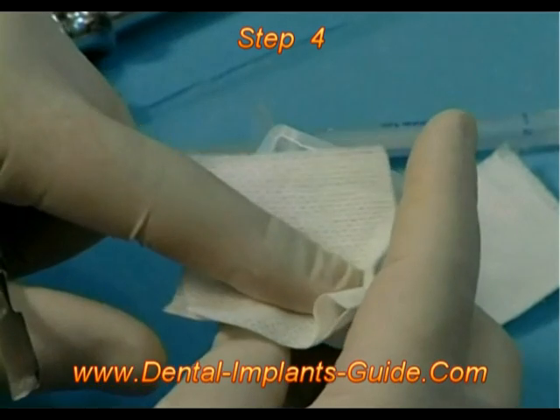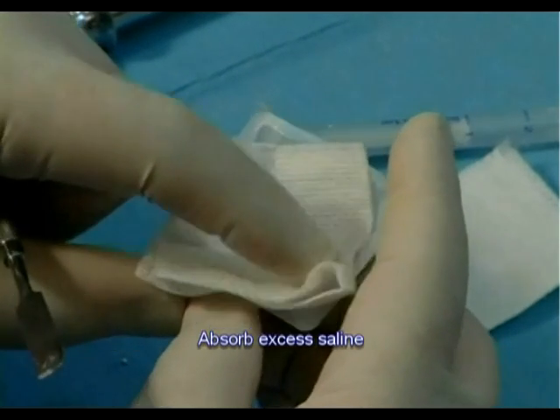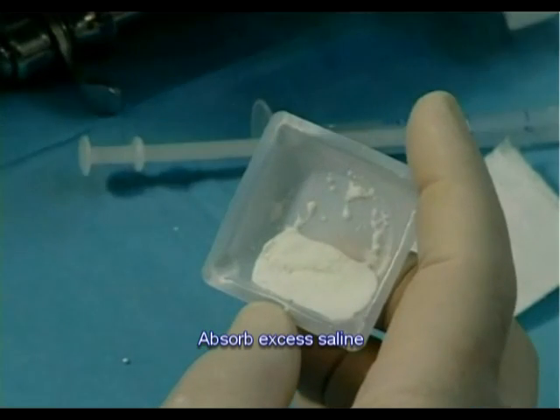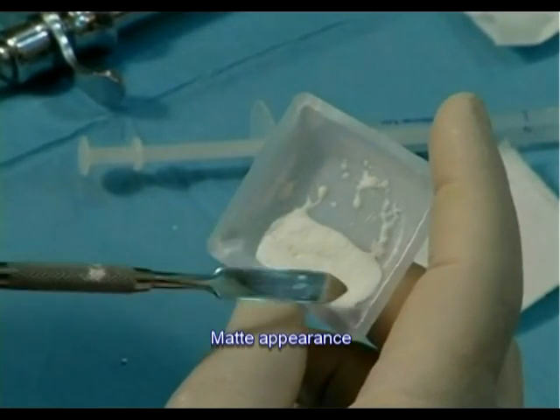Step 4: Absorb water surpluses by applying a dry gauze pad above the mixture. Do not use pressure. The texture is ready when it is well mixed and has a matte appearance.